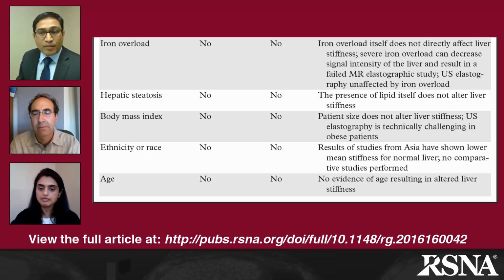And MRE can easily be performed even in high BMI patients, and even with those who have a large amount of subcutaneous fat, where ultrasound elastography techniques may fail. But I would say this, as long as the patient fits into the MR scanner, you can do MR elastography. If you cannot, then you have to go for other techniques. But unfortunately, these patients are those in which ultrasound also fails. So these are the patients in which we have to go for other techniques like clinical tests, or sometimes we might even have to resort to biopsy.